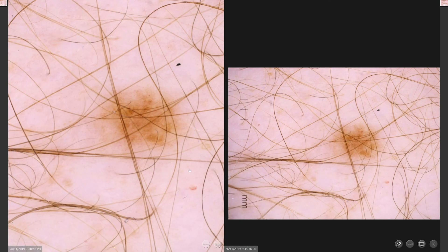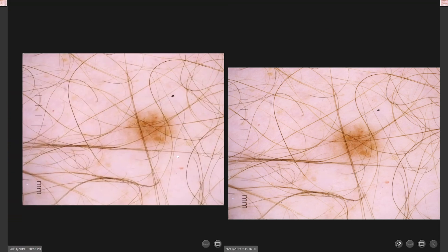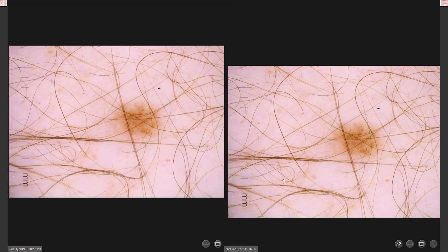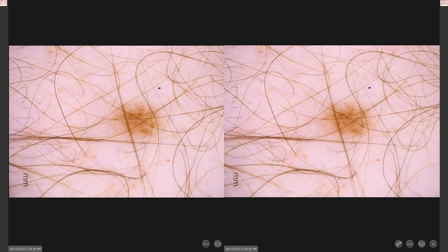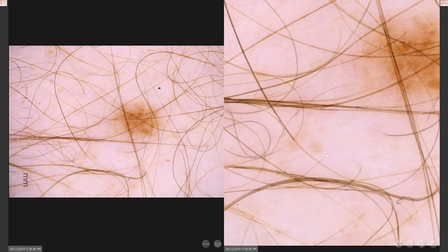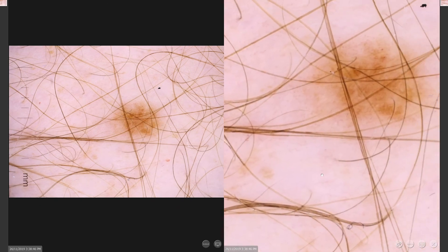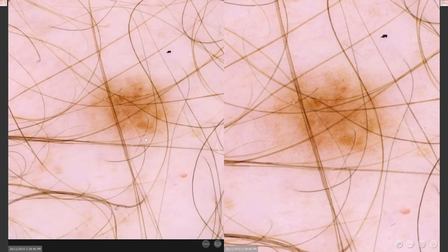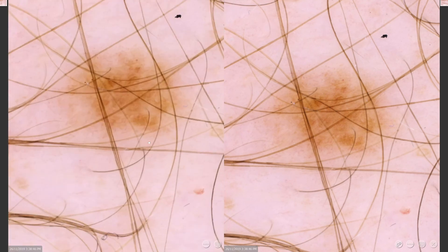From here, you may do a close-up assessment of any lesions to assess for change, by using the mouse to select areas of interest or by scrolling the wheel of your mouse in and out. To close the dermoscopic viewer and move back to the body map, select the lesion icon.